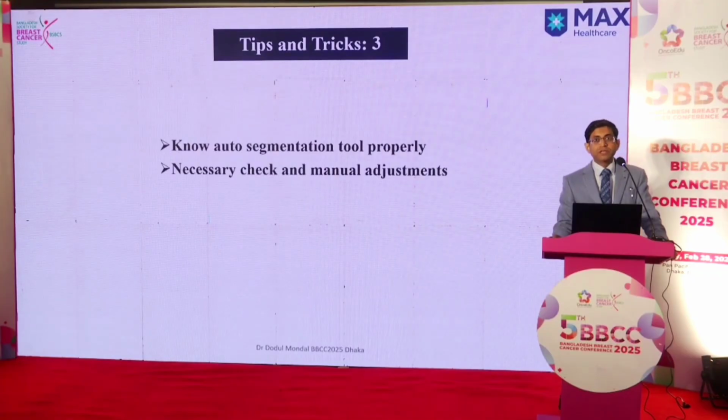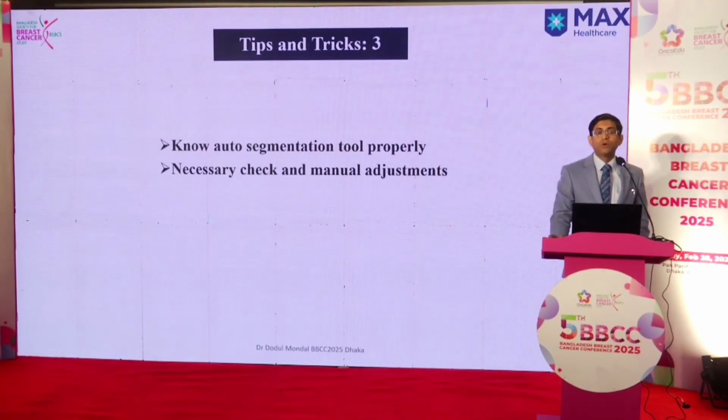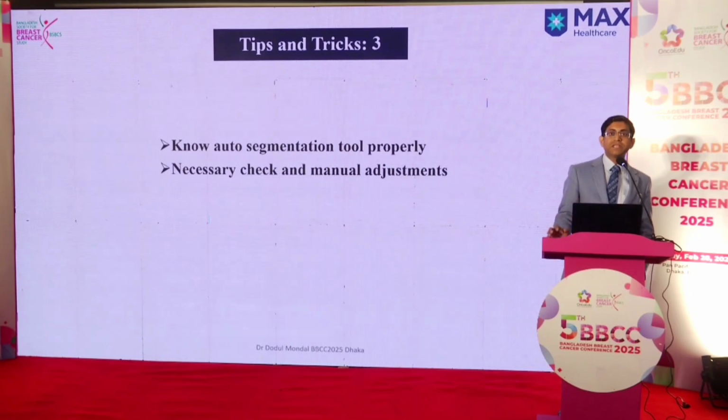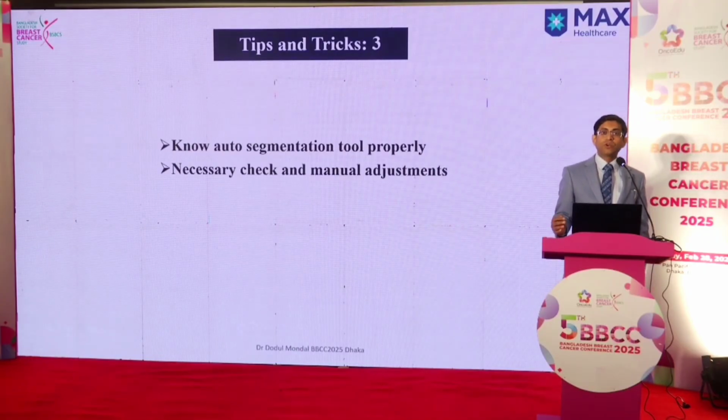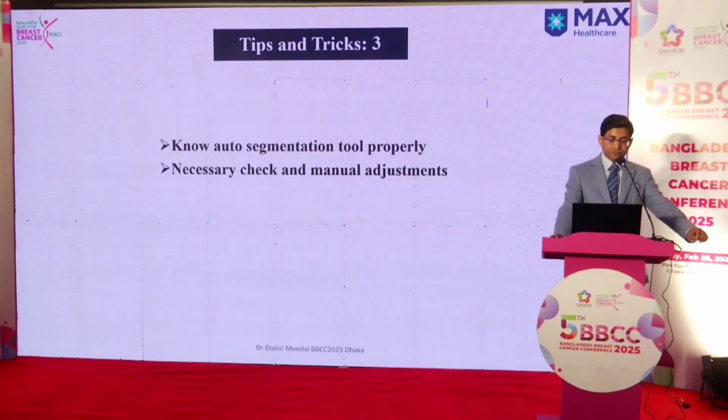There are also some differences where the structure changes all of a sudden, so be very, very careful. You must check the body and skin before you start contouring, because many of our maneuvers are dependent on the contour of the body. Like when we trim the CTV or PTV by 5 mm, we do it from the body, and if the body is not contoured properly, you may trim a larger part of the breast or a lesser part of the breast. So in both cases it will be wrong.